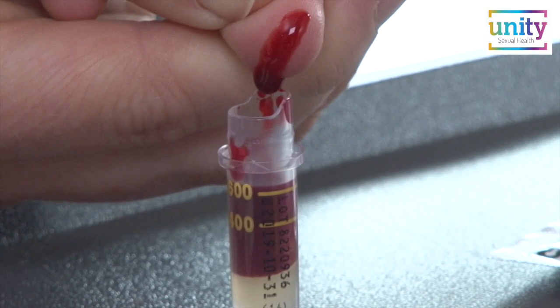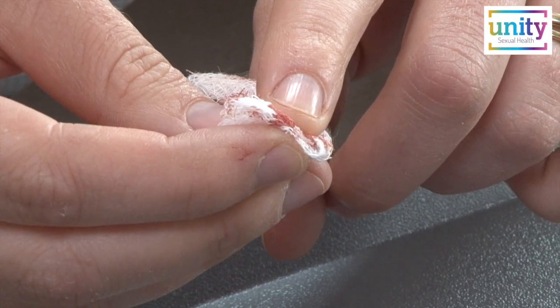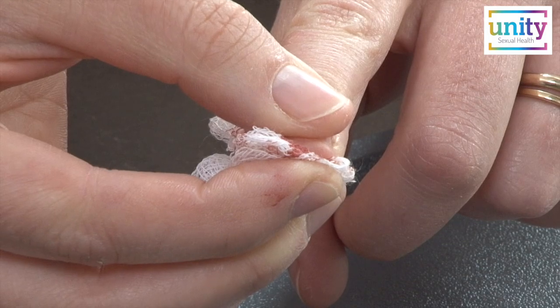Ensure the blood reaches the upper limit line marked 600 on the specimen tube. If any finger continues to bleed, apply the fabric gauze and press firmly until any bleeding stops. Avoid handling any packaging until the bleeding has stopped.